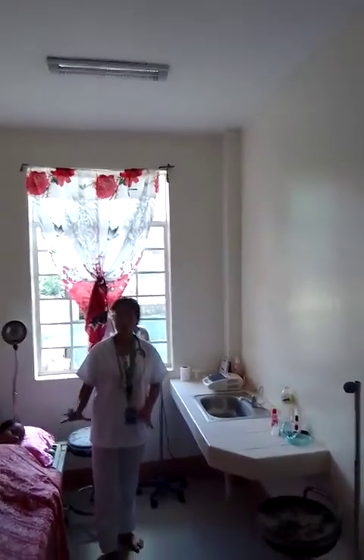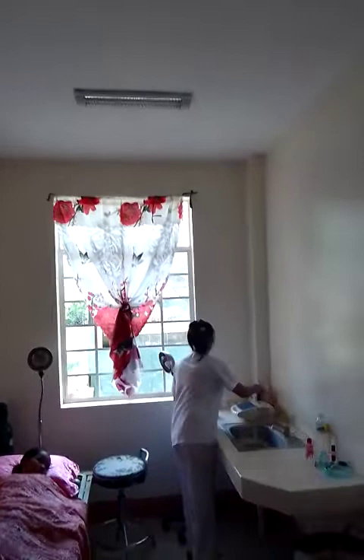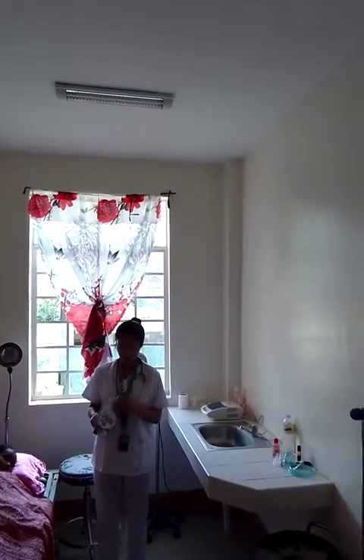This is very important. The first thing that we need to do is check the doctor's order. We cannot proceed with a procedure if there is no doctor's order, since this is the very important step in every procedure we do to the patient. The doctor's order is found in the patient's chart. I have here the doctor's order. This is the patient's chart.